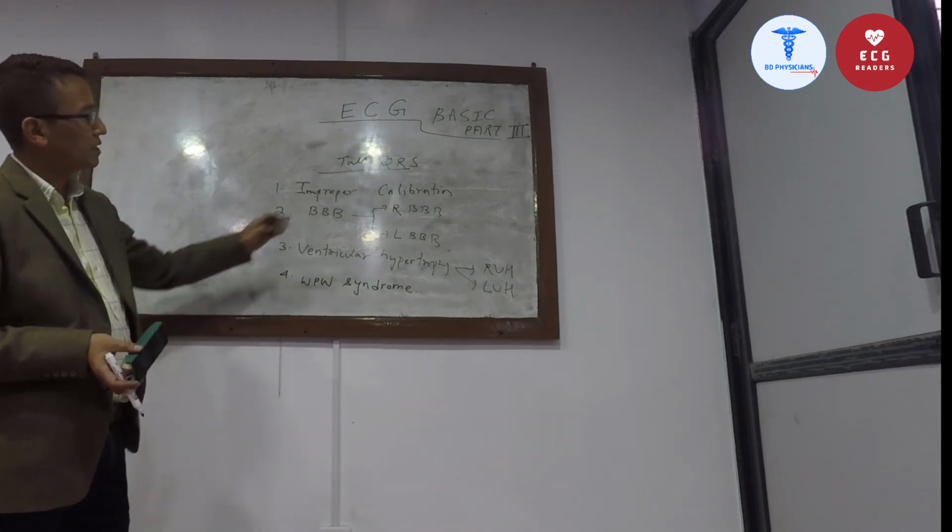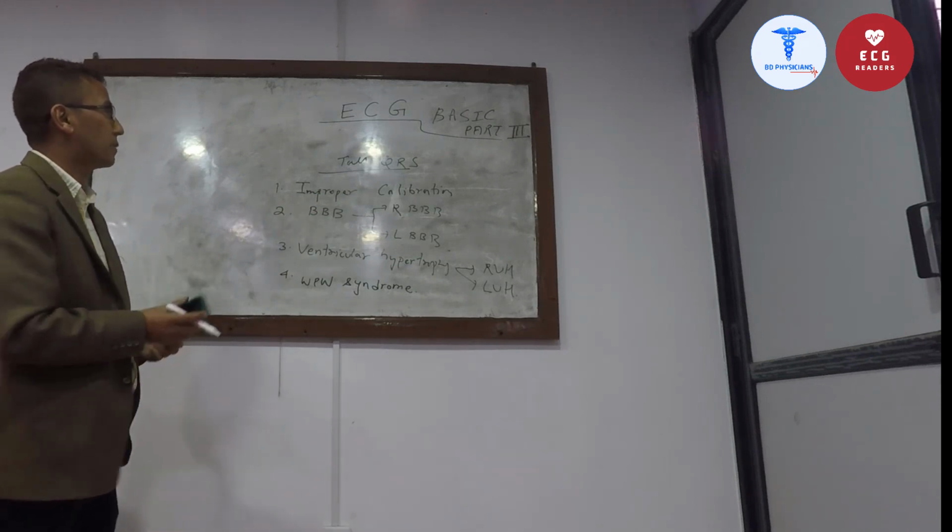Now, how will you differentiate between right ventricular hypertrophy and left ventricular hypertrophy?